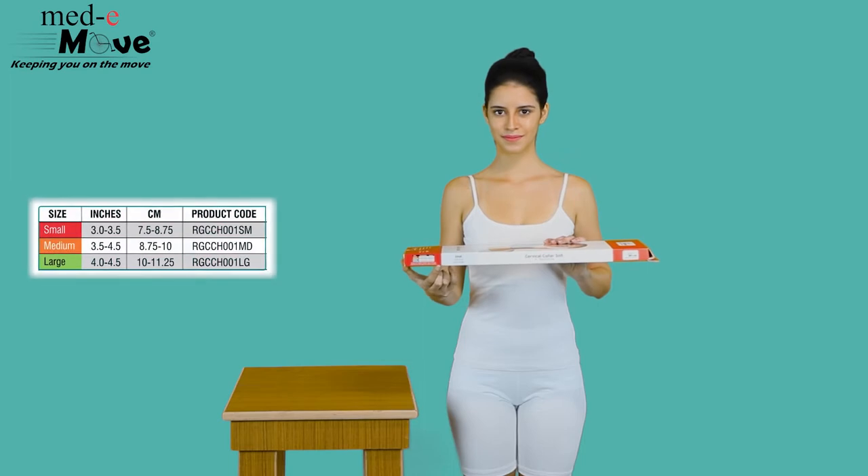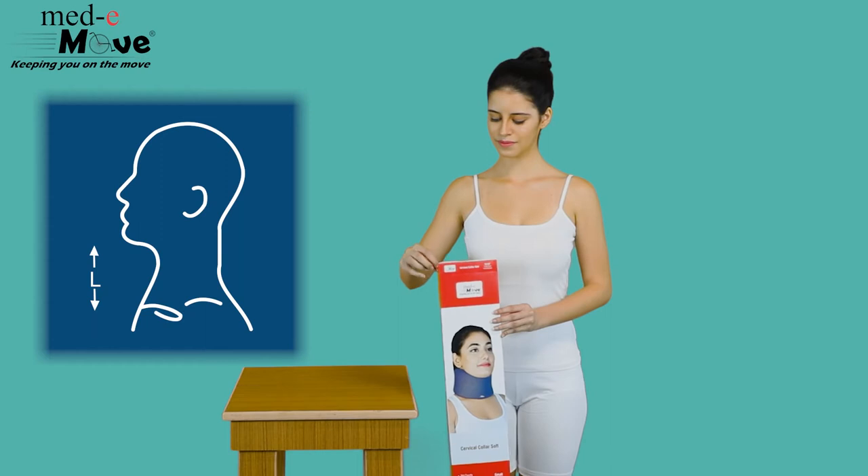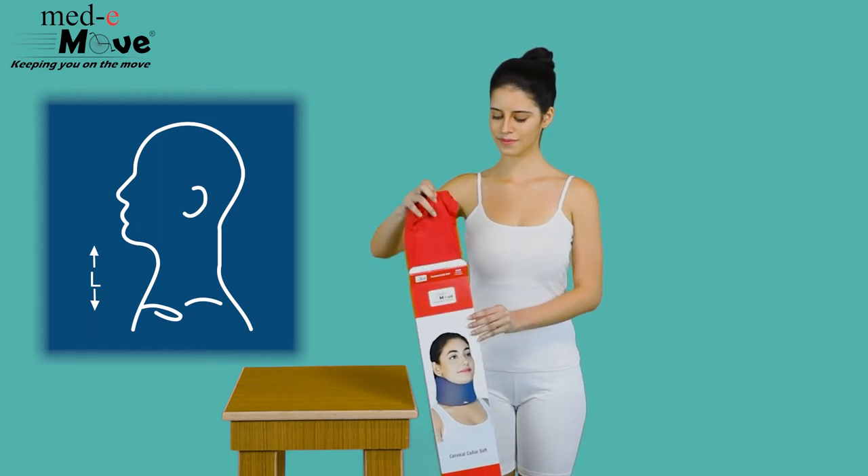The Medimove Cervical Collar Soft is available in three sizes. Measure the circumference around the neck below the lower jaw and then refer to the chart printed on the box.